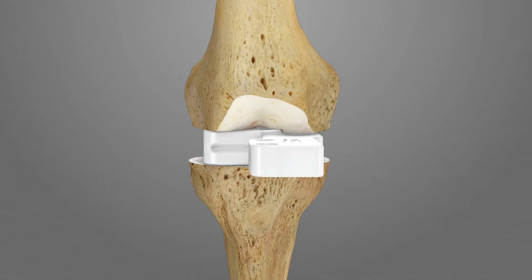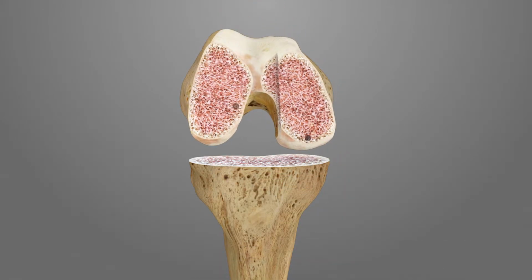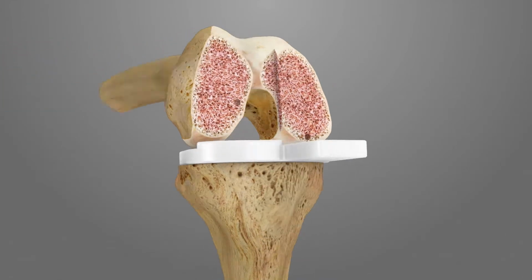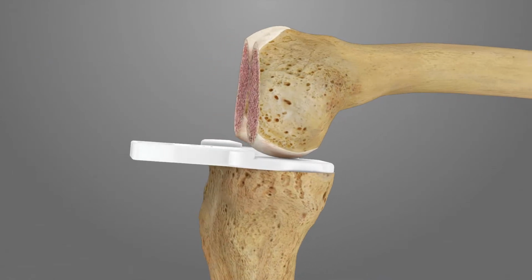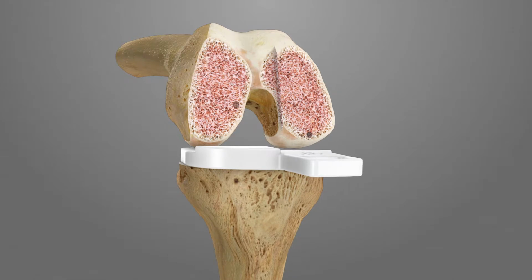Confirm full extension. Bring the knee into 90 degrees of flexion, and then place the flexion spacer iJig, T3, onto the cut proximal tibia. The femoral condyles should sit posteriorly on T3. Assess the knee for appropriate balance by applying a varus and valgus stress.